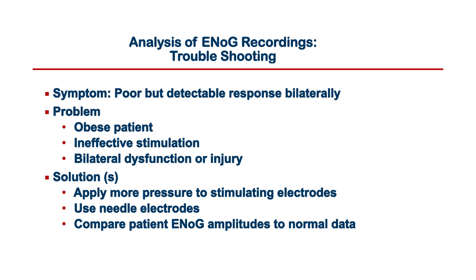physiologic explanation. It's not happened to me very often, but I've had a patient where I know there's a temporal bone fracture on one side, and that's the side everybody's worried about. The patient's unconscious, they're in the neurointensive care unit, but I can't get an ENoG from either side. Doesn't make any sense. I was expecting to get a beautiful ENoG from the side without the temporal bone fracture. So I started looking through the chart.